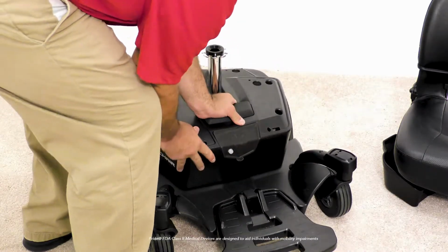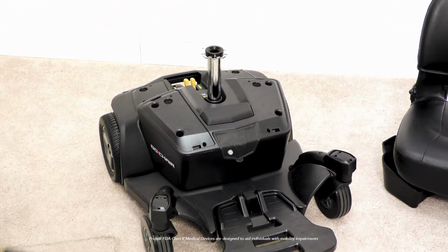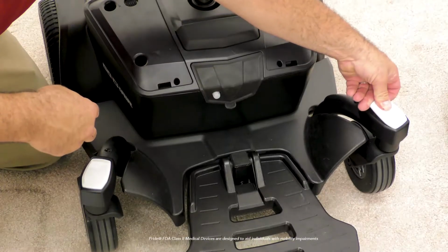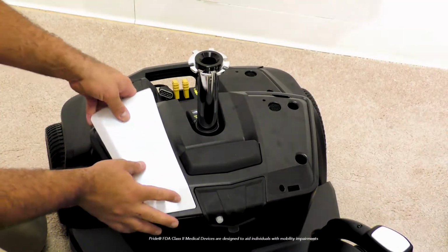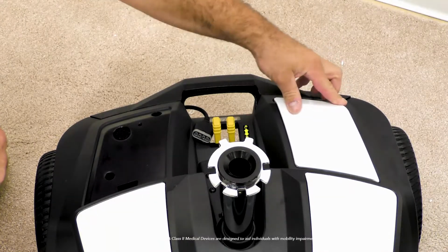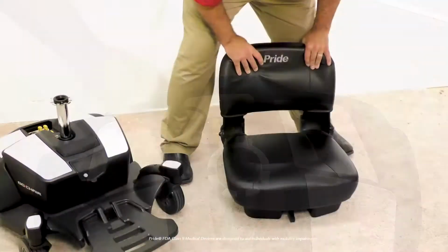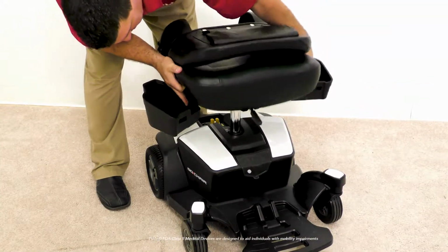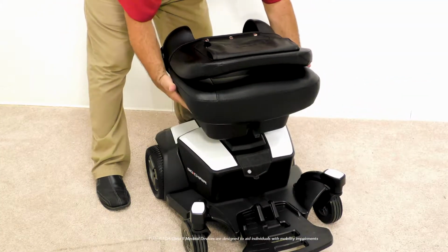Next, place the battery box on the base. Before placement of the seat, attach the color shrouds to the base, 2 on the front caster caps, 2 on the battery box, and 2 on the rear unit. Place the seat on the seat post. Make sure the underseat storage is open before placing on the post.